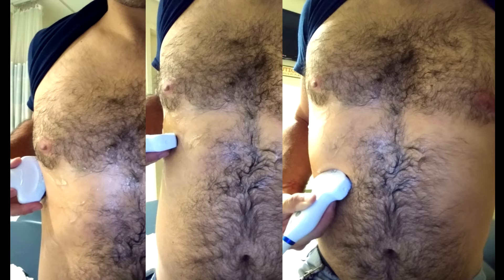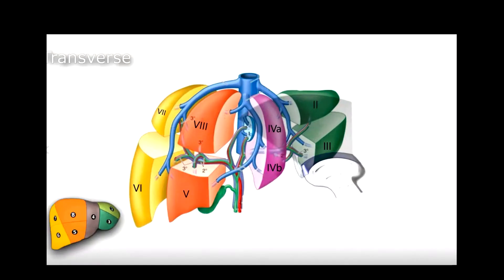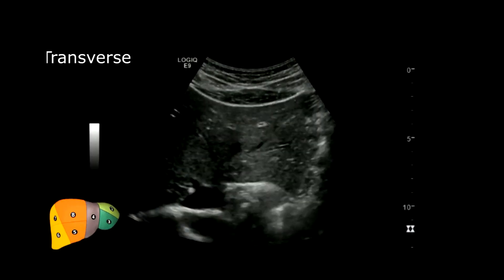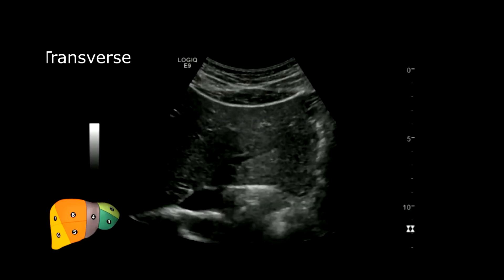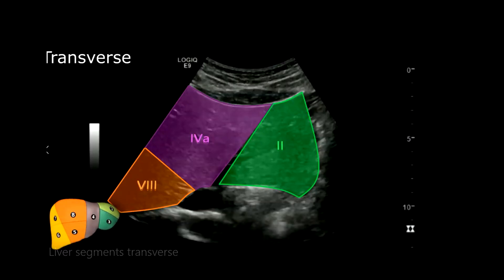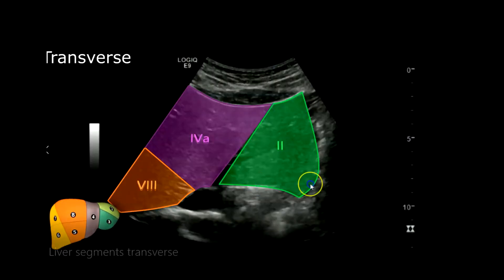In transverse, this is the superior segment of the liver — segment 2 at the top. Scanning in the superior region you'll see segments 2, 4a, and 8, so we're scanning around that superior region. Segment 2 is lateral left, 4a is medial left, and 8 is right anterior superior.